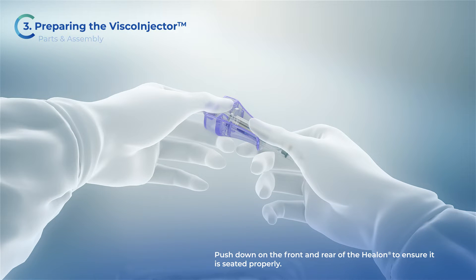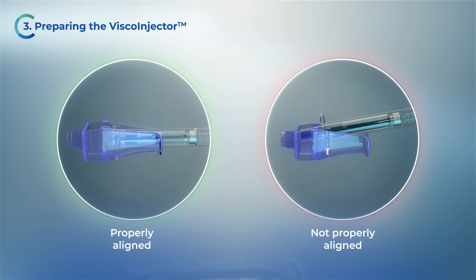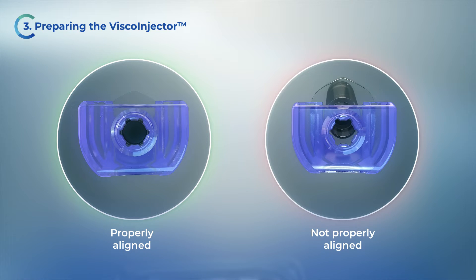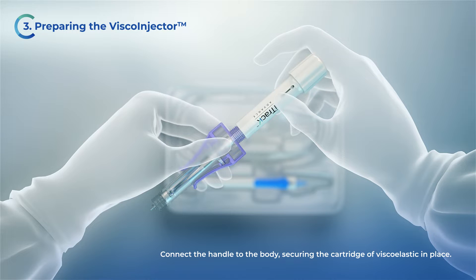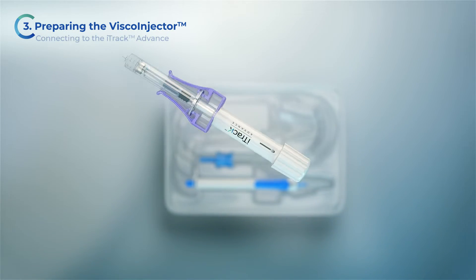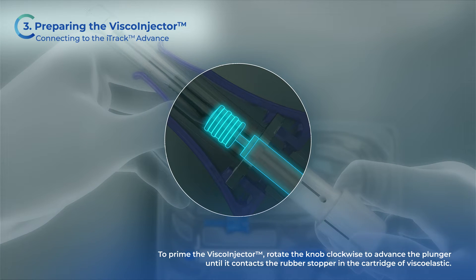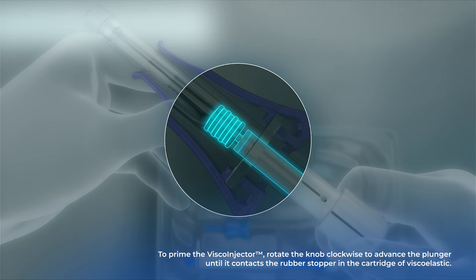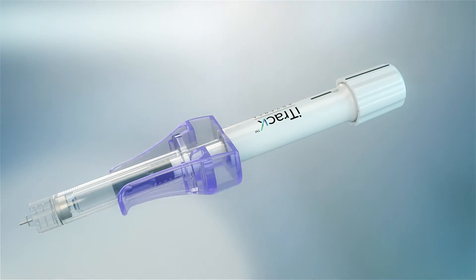Push down on the front and rear of the Helon to ensure it is seated properly. Connect the handle to the body, securing the cartridge of viscoelastic in place. Rotate the knob clockwise to advance the plunger until it contacts the rubber stopper in the cartridge of viscoelastic. The viscoinjector is now assembled.